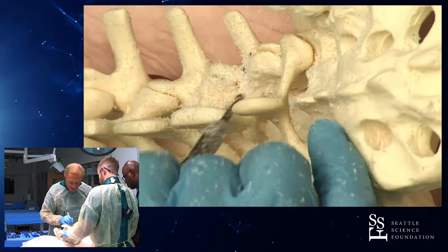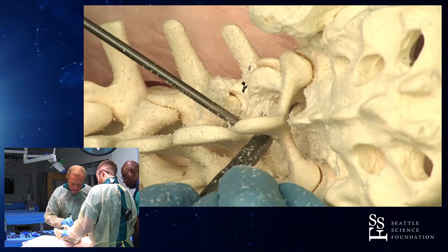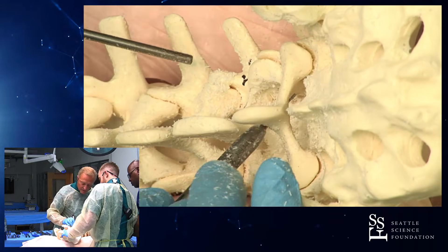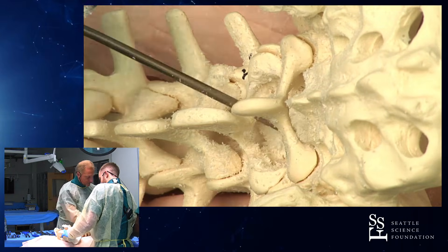Now, what have we accomplished with this? What do we want to have? We want to have the lateral recess opened up. And we want to have access to the nerve roots above and below.